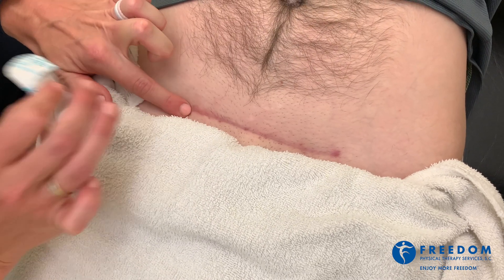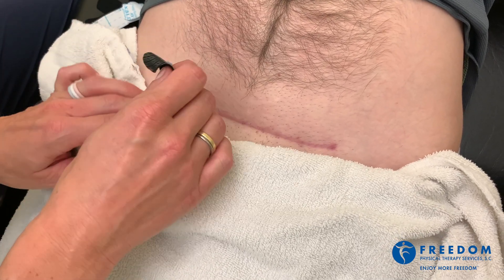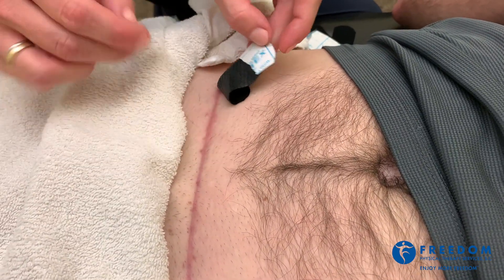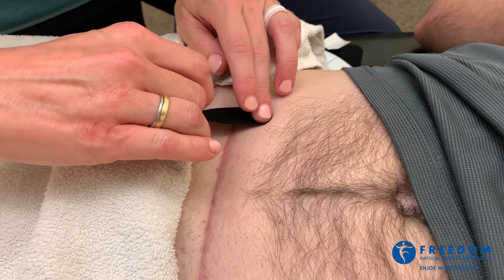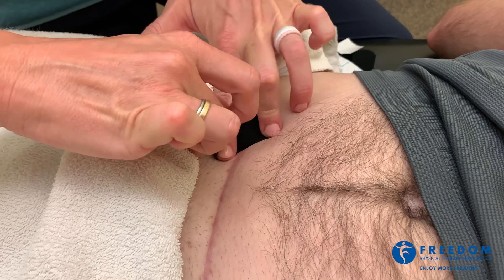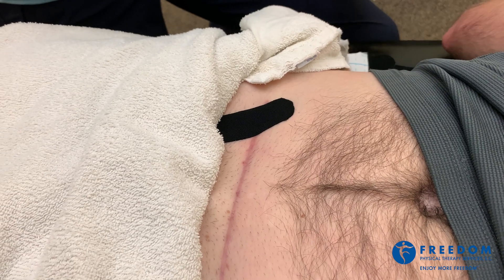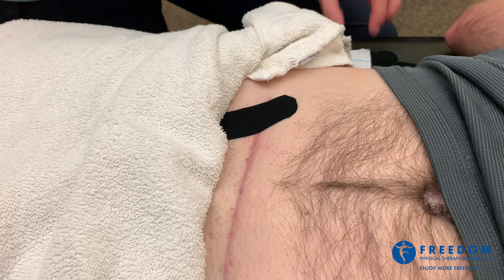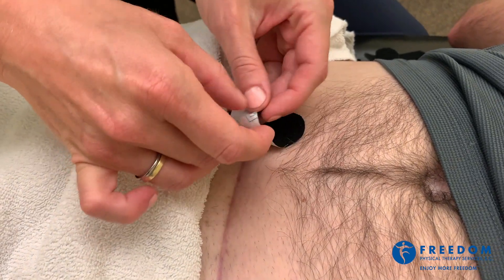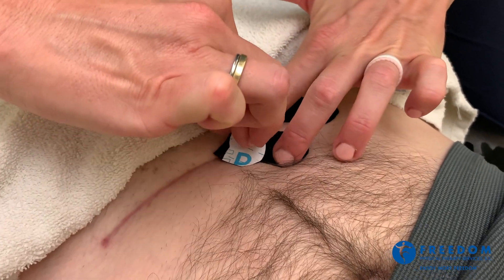Surgery went well but the scar is a little bit stuck, so we're going to use a taping technique to help loosen up the scar. We start by coming across the end of the scar, putting about 20% stretch on the tape and then no stretch on the ends. We're going to come across the entirety of the scar in this diagonal fashion.